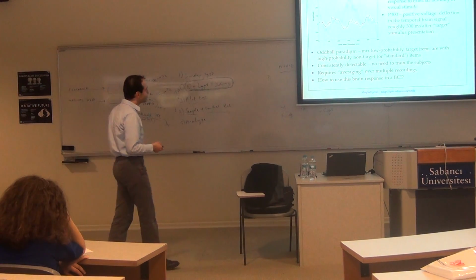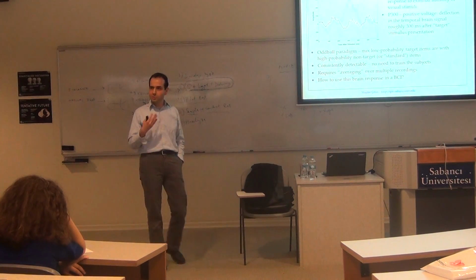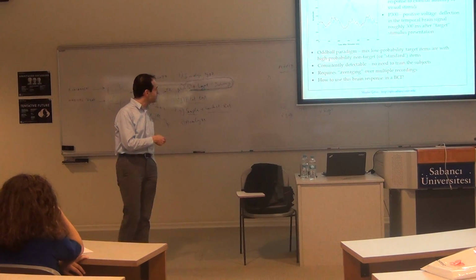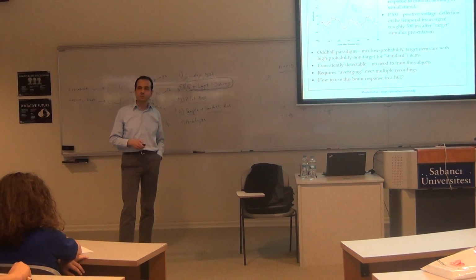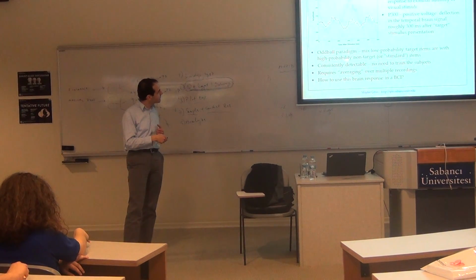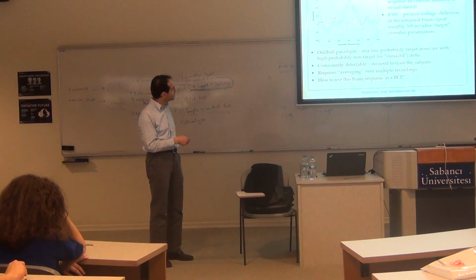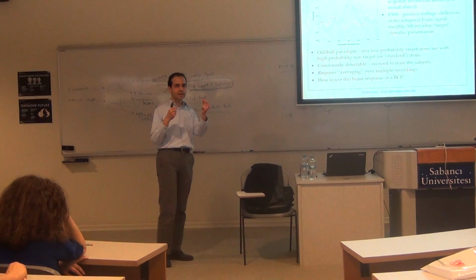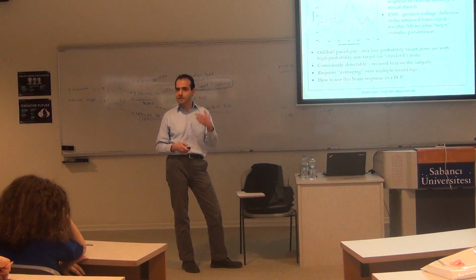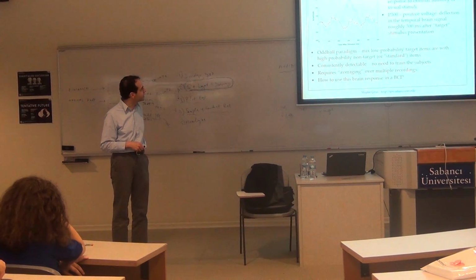So how do we exploit it? Well, first of all, this should happen infrequently. It shouldn't always happen, otherwise we won't generate this response. So you use what's called the oddball paradigm. You show the person high probability non-target or standard events mixed with low probability or surprising target events. If you do that, you have a chance of detecting this positive deflection in the brain signals.